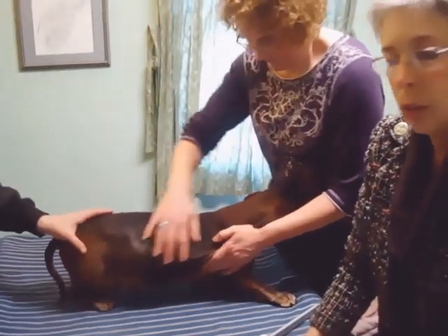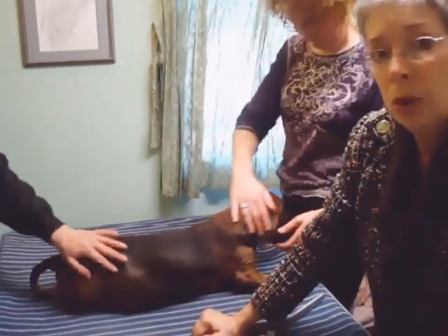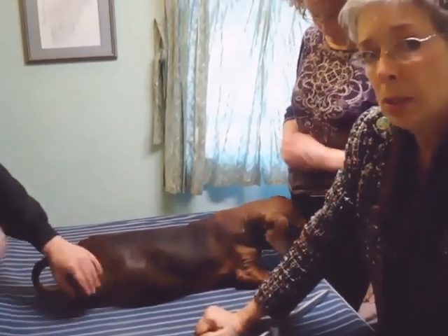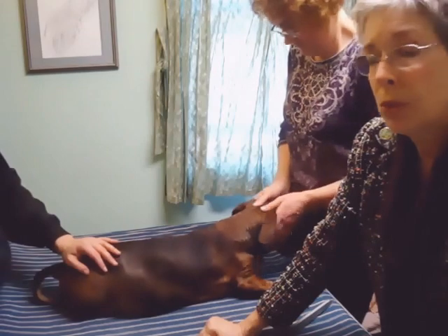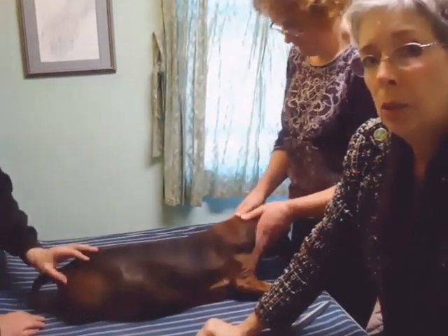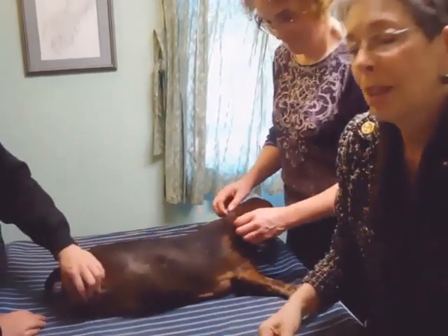And that is how you measure for a quad. If you are a veterinarian or even a homeowner doing this, feel free to call us when you're taking these measurements and run them by the person in the office. If we have questions about any of the measurements, we'll tell you which ones to double-check. Thank you very much.